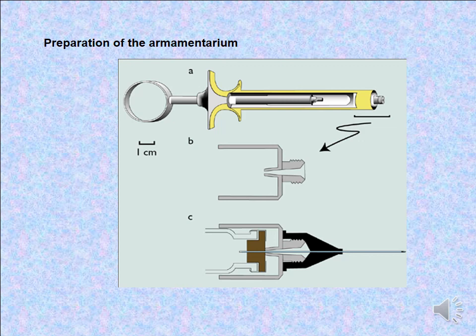Then put a needle through the center of the diaphragm and thread it on until it is very carefully and strongly attached to the dental needle adapter of the syringe. You can use it, and you can remove it in the opposite direction.